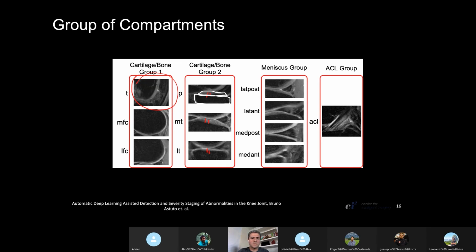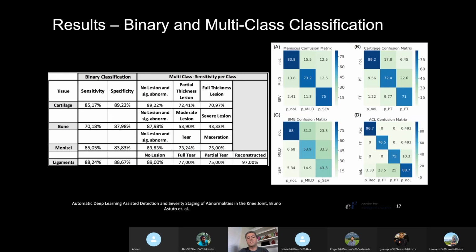Once I do the segmentation, I crop the image, and I use these cropped 3D images as input to the classification networks. And these numbers here are the accuracy numbers for the classification only. I mean, you are not processing the whole pipeline here and showing the results, only the classification part on a separate data set, right?